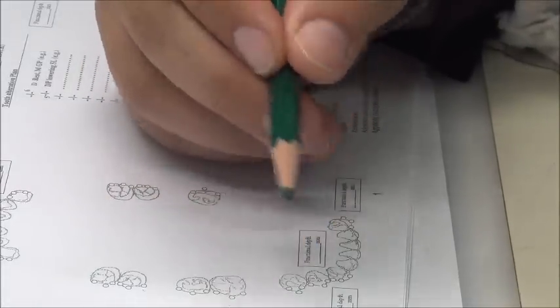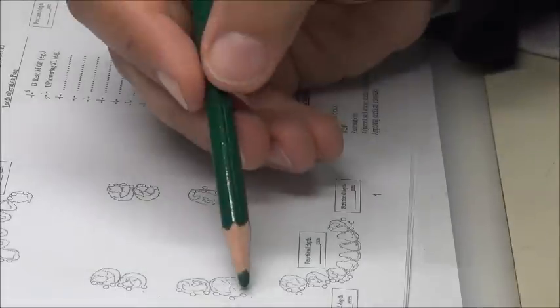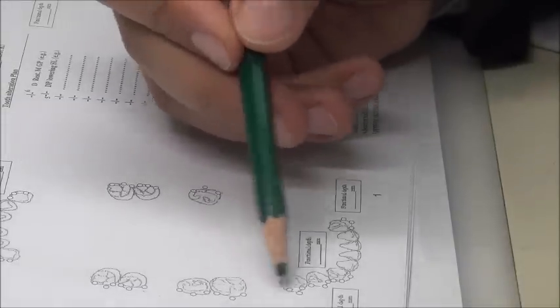And the Akers clasp already includes the Akers design on the rest, the clasp, the reciprocal arm, and the guide plate, right? So we have finished four components in one. When we say Akers, it contains these four components. So we're left with the resin retention area and the major connector. The design contains these components.